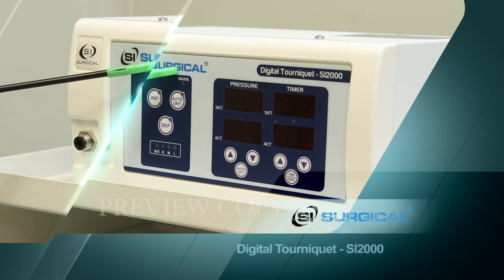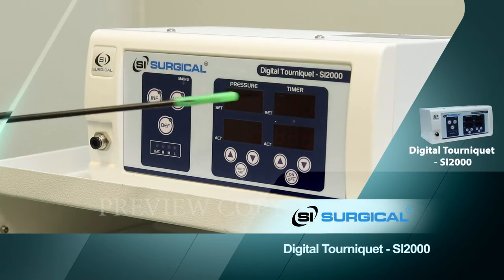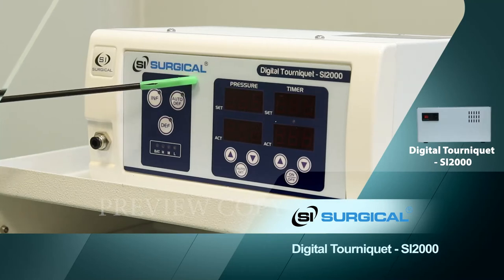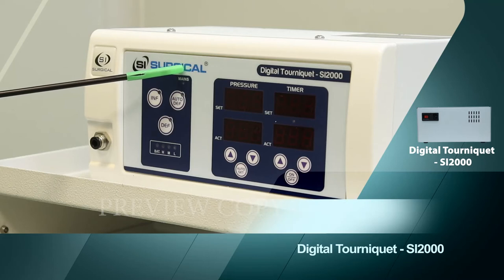This is a digital tourniquet machine. The model number is SI-2000. It is used for hand OT, like orthopedic OT, and it has one connector.